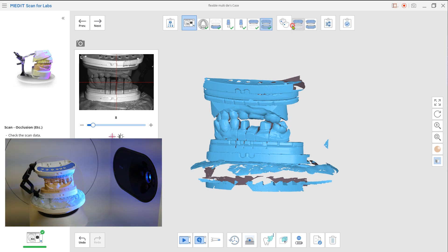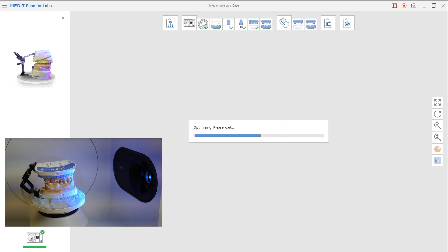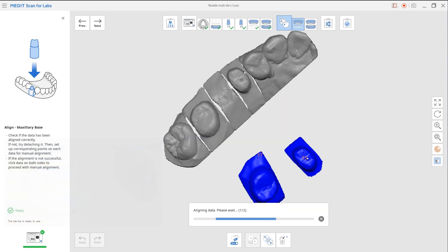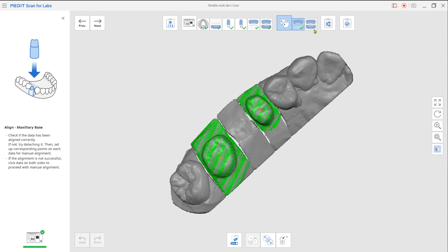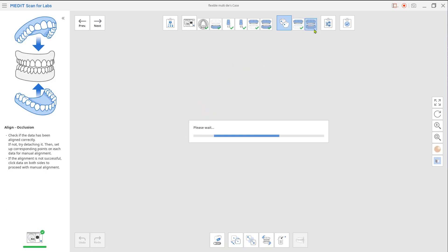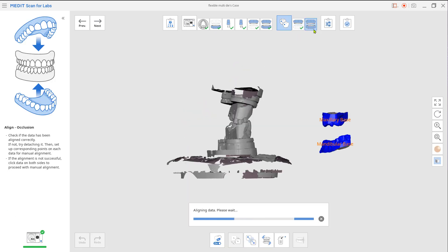Go to align data and click on the maxilla. In this step, the system will automatically merge them together. Now go to occlusion and merge all arches to occlusion scan data.